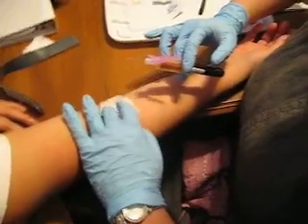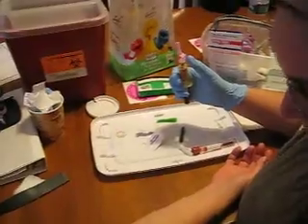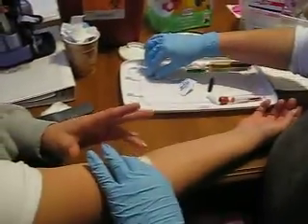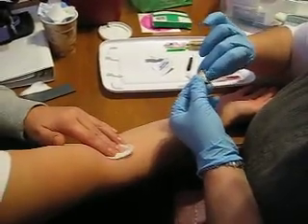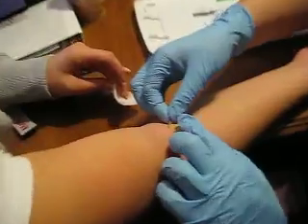It is a good idea to try to pull the tubes back first, just so that you get blood back out of the needle, just to reduce chances of contamination. Can I hold that for you? Yeah. You did it! Yay! That's huge. It is. Having the composure to do it the second time when you lose it — I know.